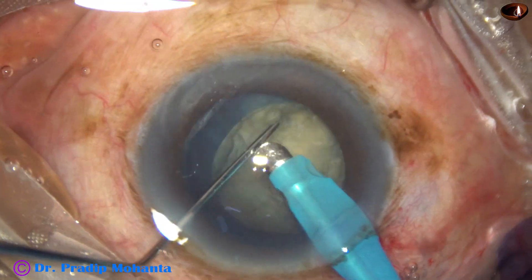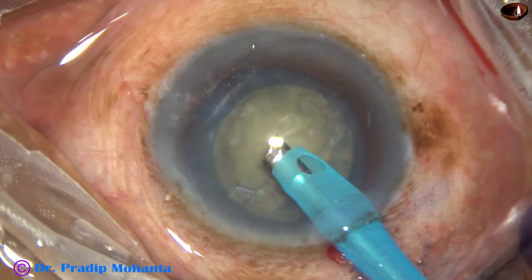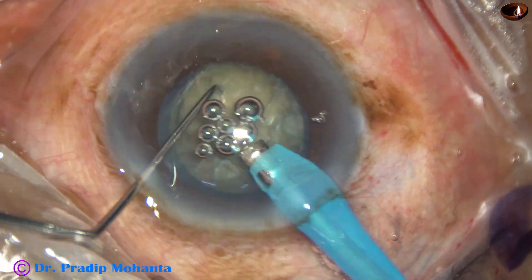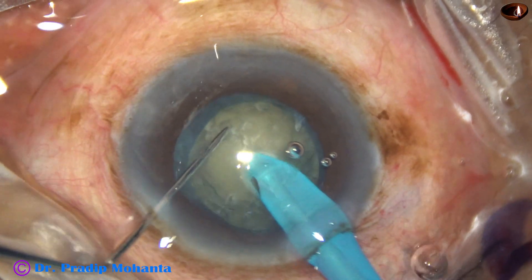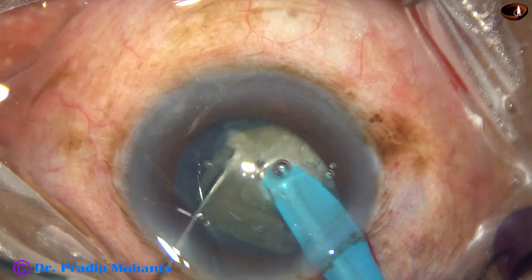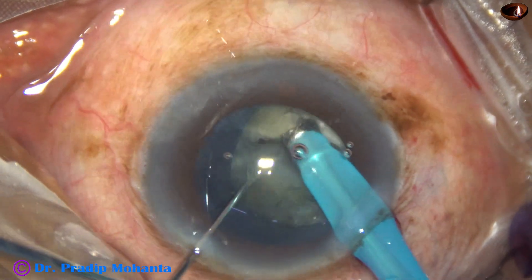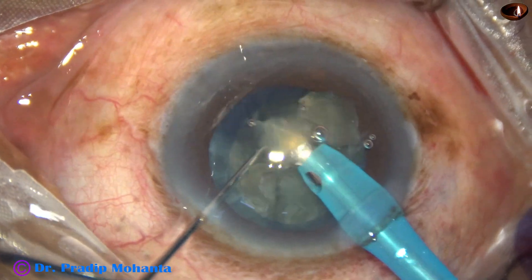And now, let us observe direct chop. Turn the handpiece, make the bevel up, and bury the tip into the substance of the nucleus. Hold the nuclear mass very firmly and chop. Rotate the lens 90 degrees and chop again. This free nuclear fragment is then emulsified.